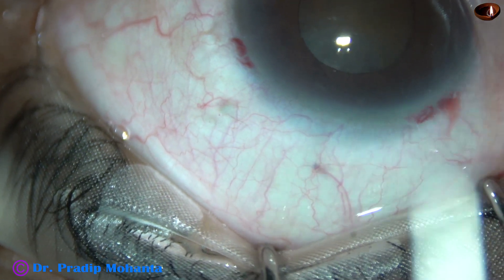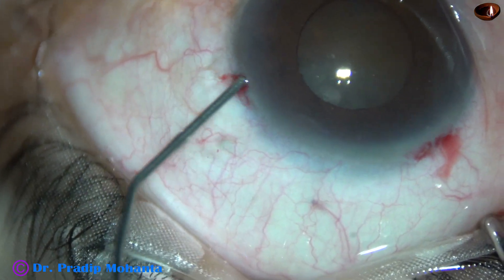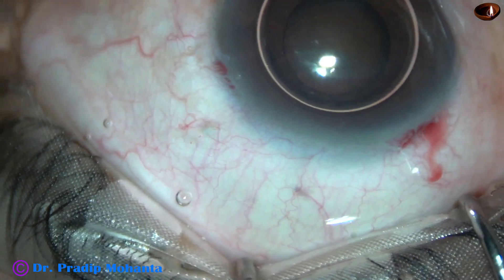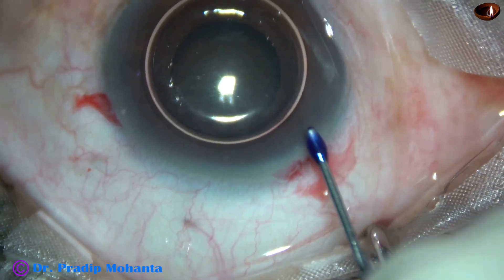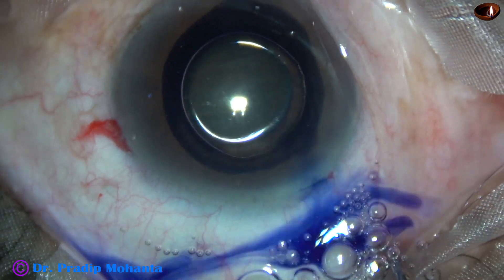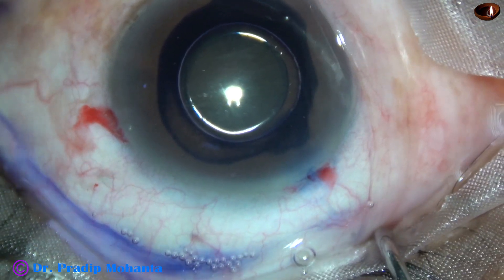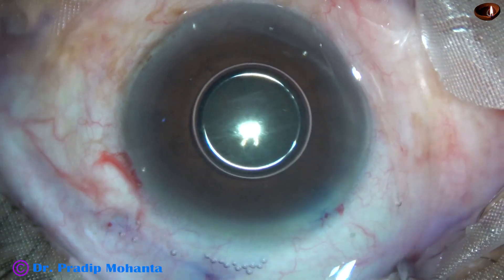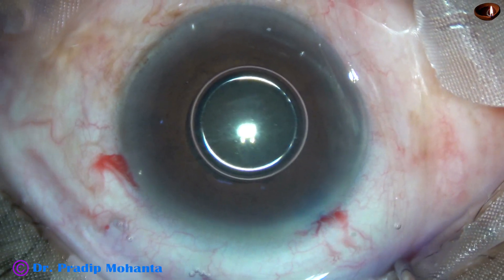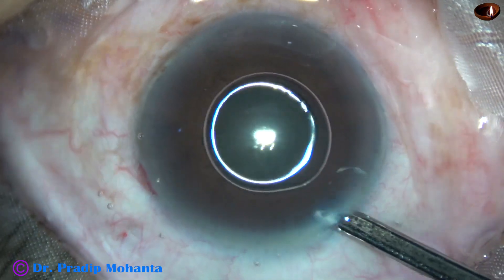about 3 o'clock hours away. An air bubble is injected. Beneath this air bubble, trypan blue dye is applied over the anterior capsule. This is a bit of adrenalin, but in this case, the adrenalin didn't work.